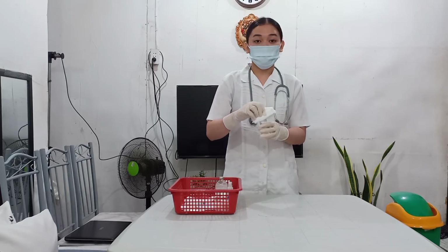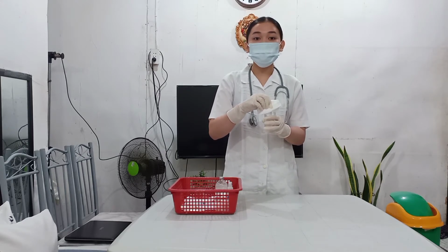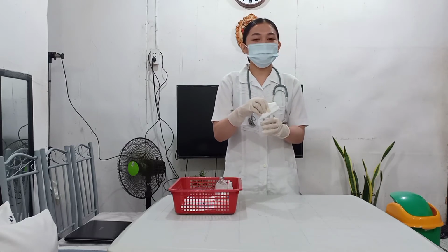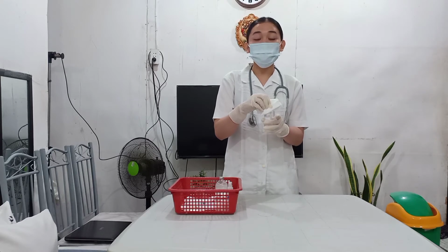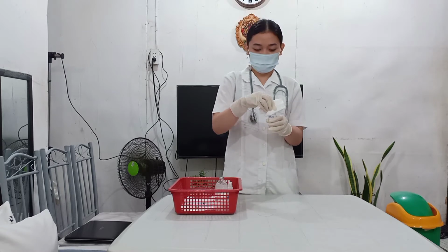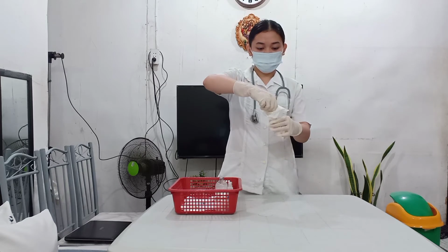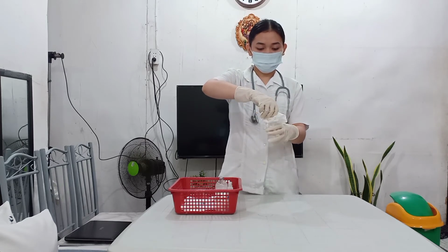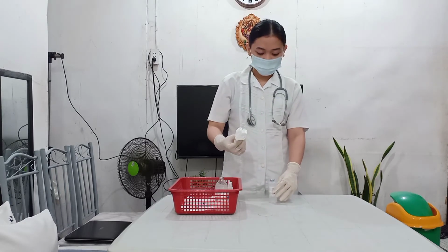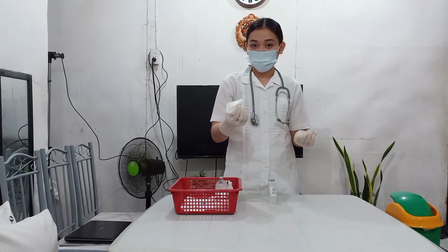Now, next is to break off the top by bending it away from me to ensure the ampule is broken away from myself and away from others. This protects the nurse's face and finger from any shattered glass fragments. Okay, so I have already here the top of the ampule broken.